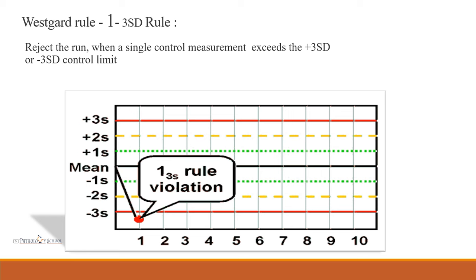The following slides show the interpretation of Westgard rules. The first is the 1-3SD rule: reject the run if one single control measurement exceeds plus 3 SD or minus 3 SD. Here, the control value is exceeding minus 3 SD, so this run is rejected.